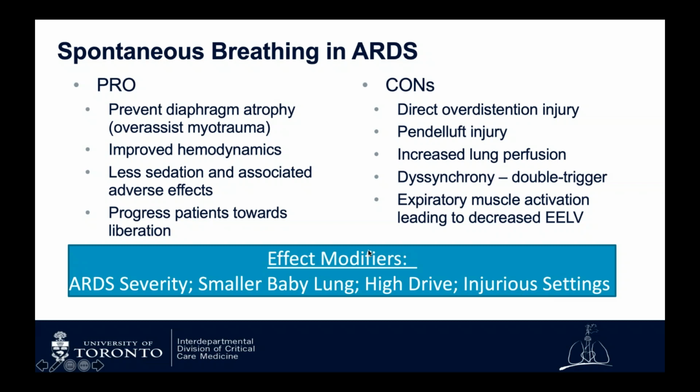And all of these things may be made worse by effect modifiers of the severity of ARDS: the smaller the size of the baby lung, the higher the drive that the patient has, and the more injurious the baseline settings of the ventilator are. All of these things tip the balance towards spontaneous breathing in ARDS being even worse.